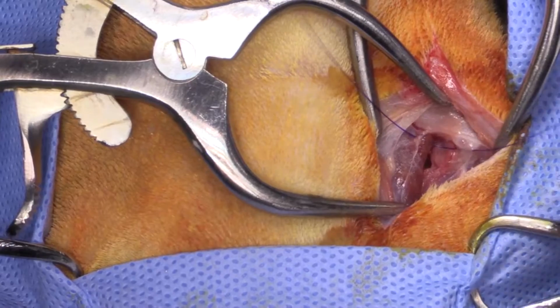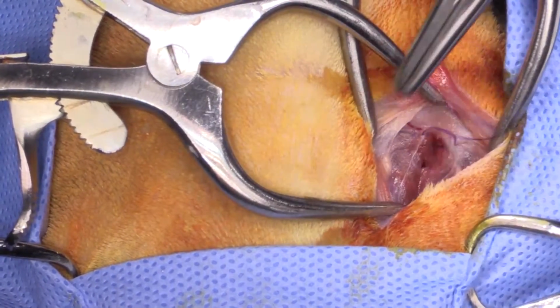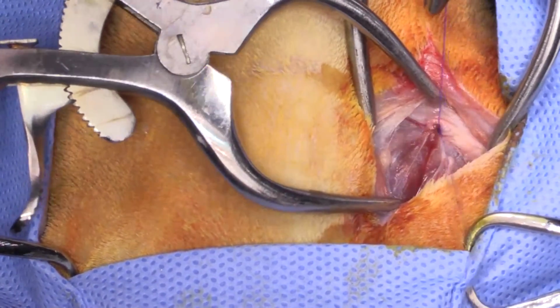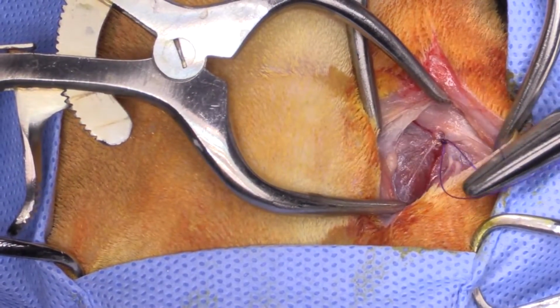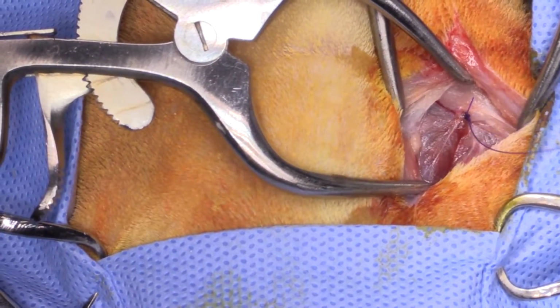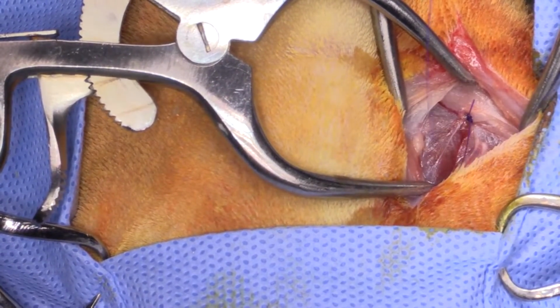And so we are going to do ventral bulla osteotomies on both sides, get rid of all the soft tissue that's in there, and then go back in the nasopharyngeal region and just pull the polyp out via an oral approach. This is a 7-year-old cat. It's a little bit old for inflammatory polyps, but we certainly can see them at that age.